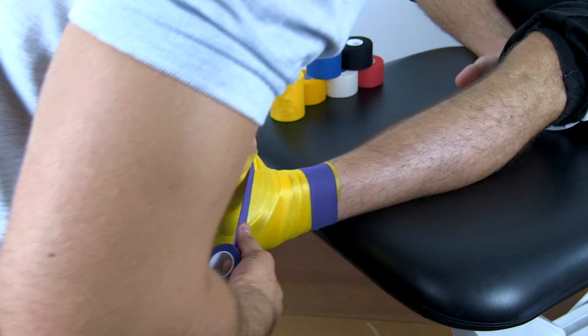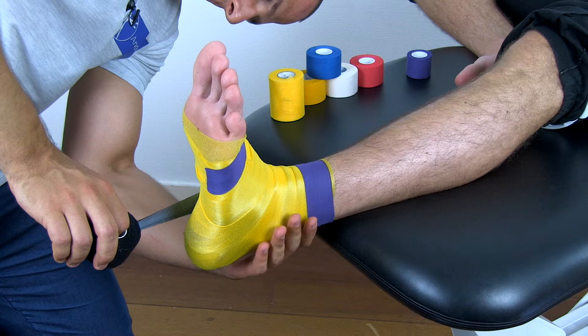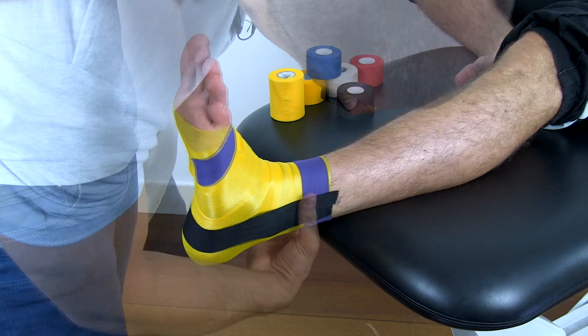Start taping a stirrup over both malleoli from medial to lateral. Make sure that the strips are taped with continuous stretch. I like to fixate all strips at the anchor points with another layer.